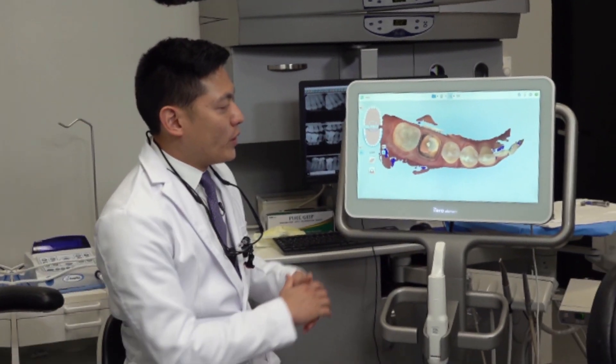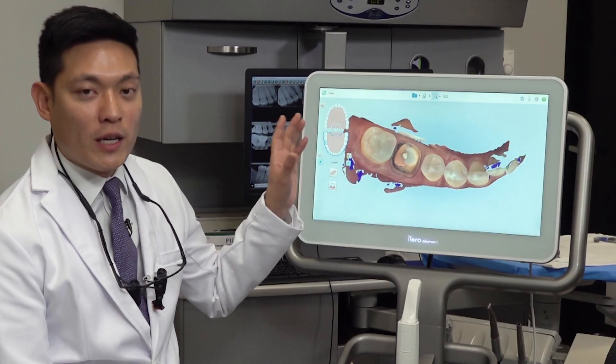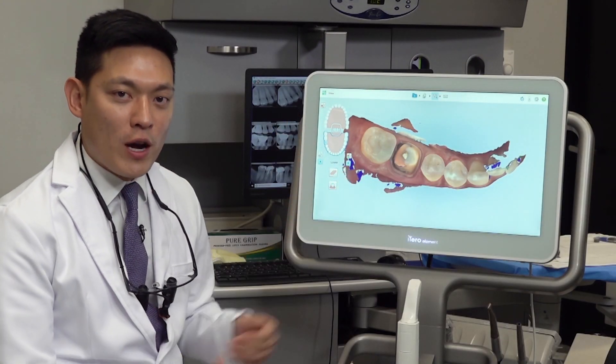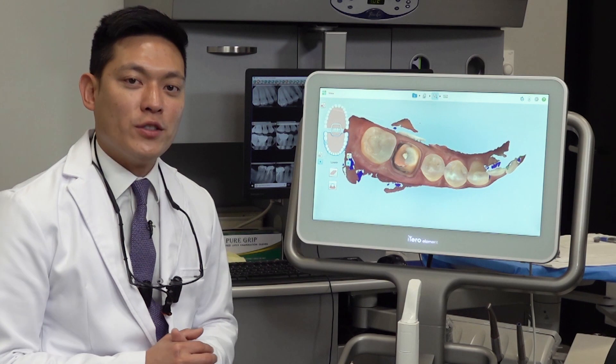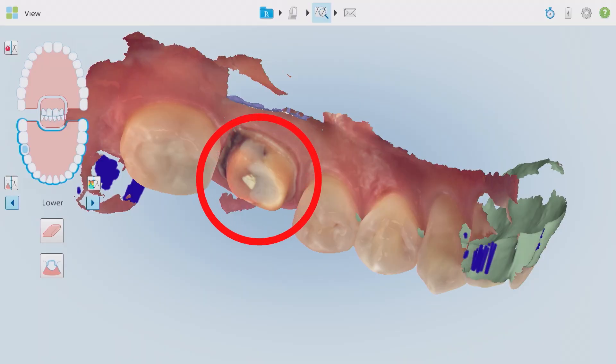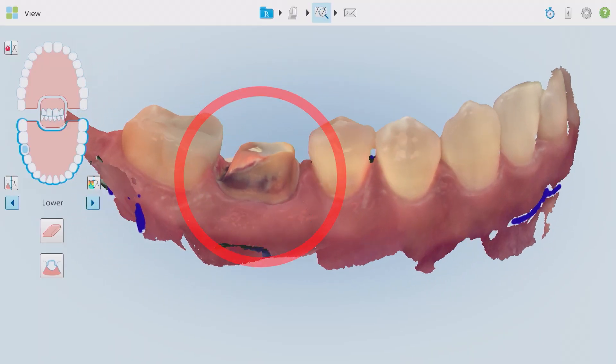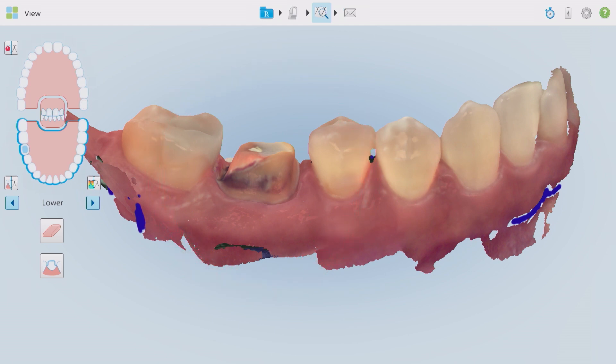So we have our preparation — in this case a single unit crown prep on tooth number 30, the lower right first molar. You can see it here, and the entire quadrant.